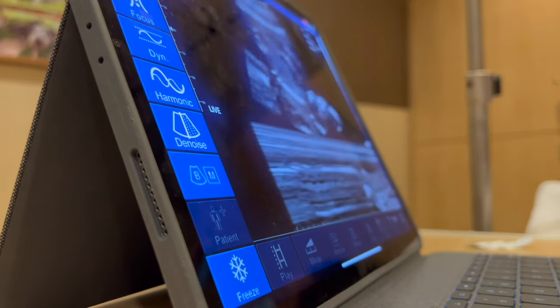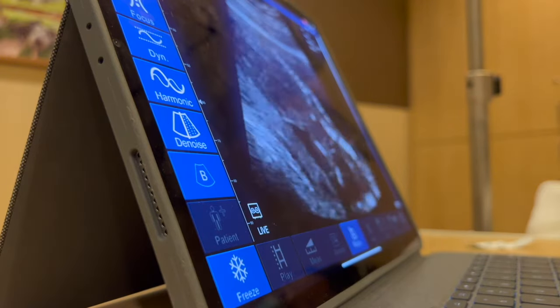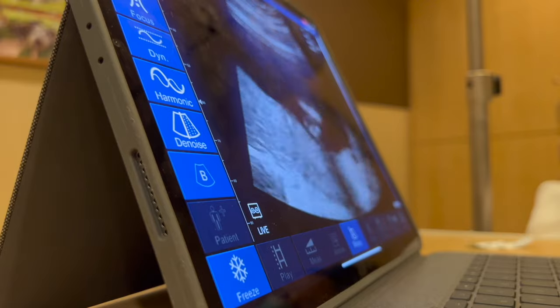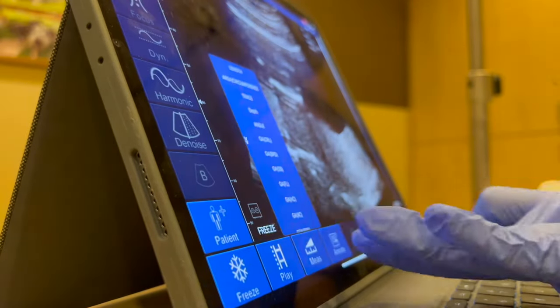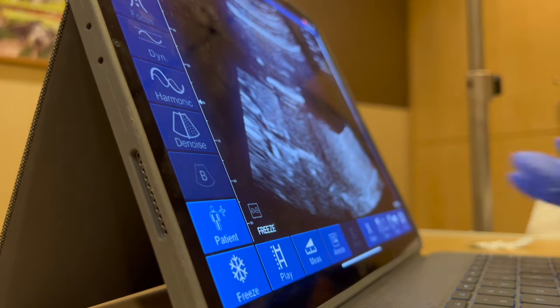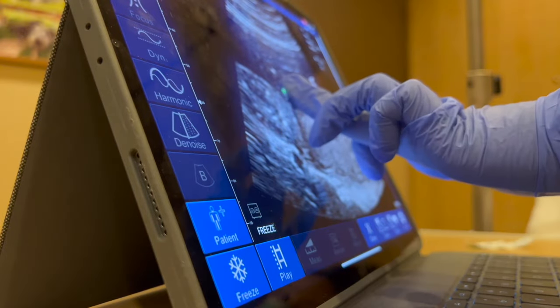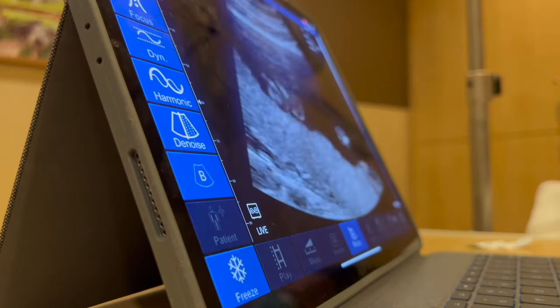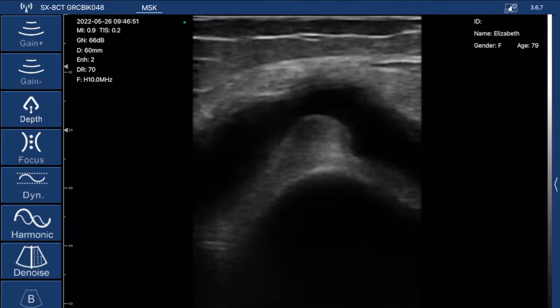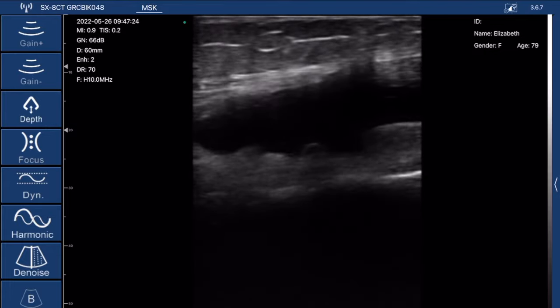I'll show you videos of how I've used this probe on different scans so you can see the kind of results it produces. It pretty much does everything you could think of. It's great for doctor's offices, for your own business, or for fast exams in the hospital setting — it makes it a lot easier and quicker to provide an ultrasound at the bedside than to grab a giant machine, plug it in, and wait for it to boot up.